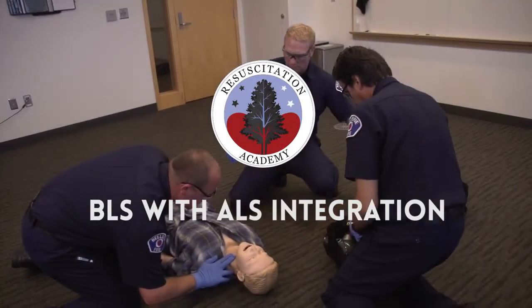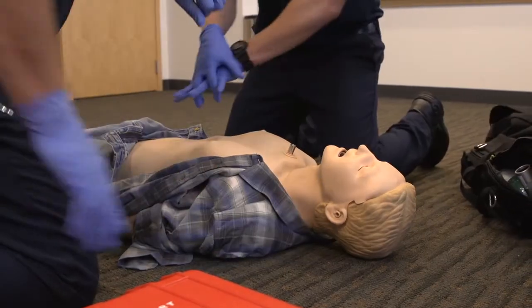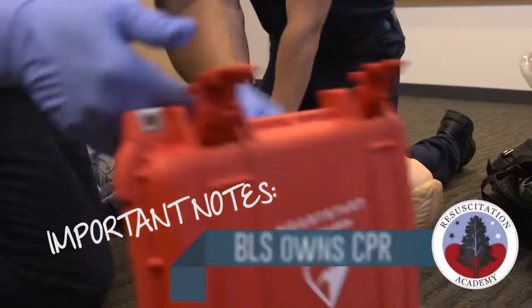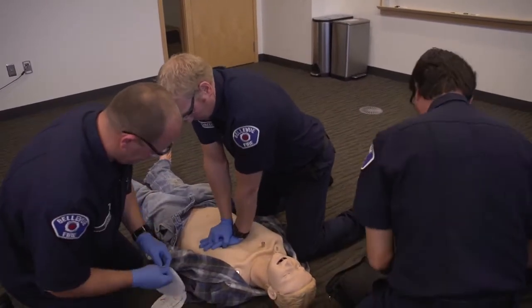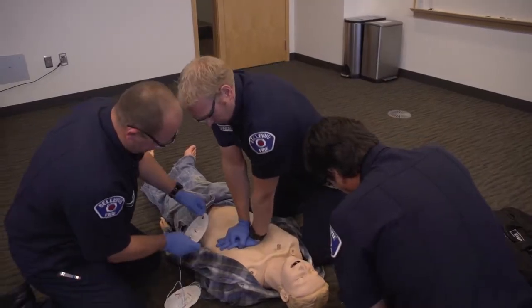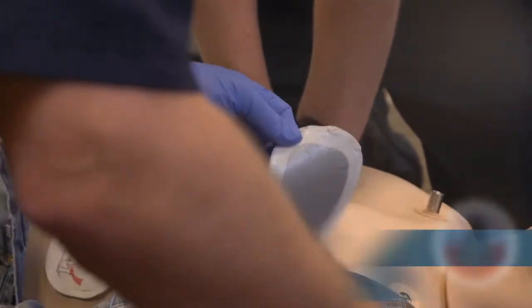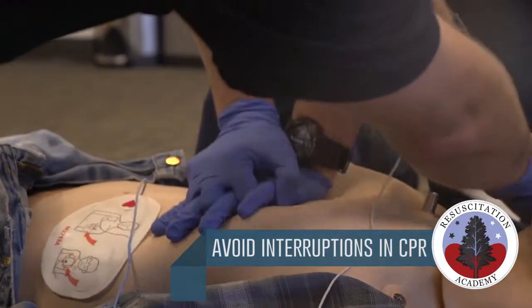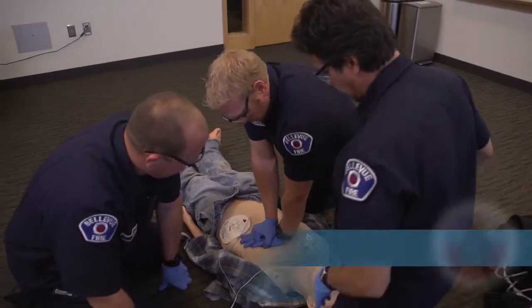Sir, sir. No pulse. Start CPR. Apply pads. Plug-in pads connector next to flashing lights.